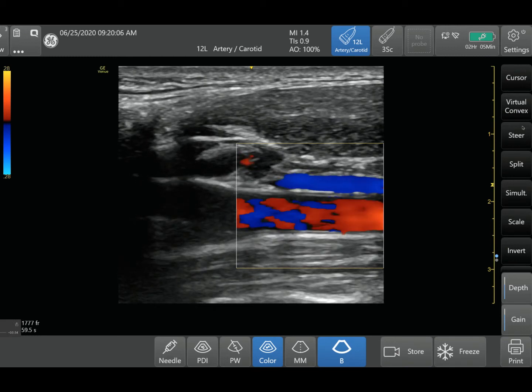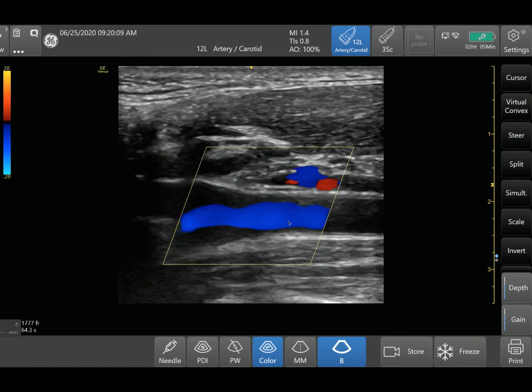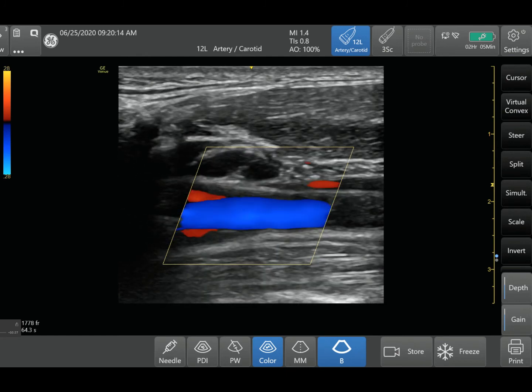What you can do is use a function called steering — there's a steer button right here. After activating steering, you can actually see that the blood flow is going away from the probe. This steers the angle so it's not at 90 degrees anymore — it's more of a 20-degree angle. So when you can't get a perfect angle on your color Doppler, sometimes you have to use steering mode to get better color Doppler signals. Before you could only see mixed blues and reds, but now you can clearly see that this blood flow is going away from the probe.